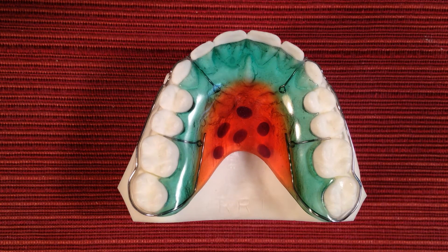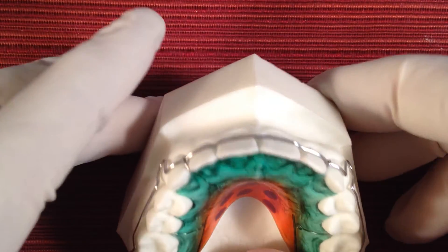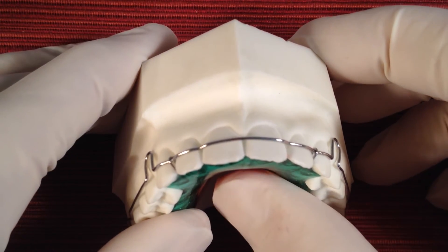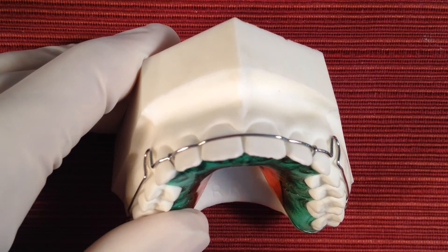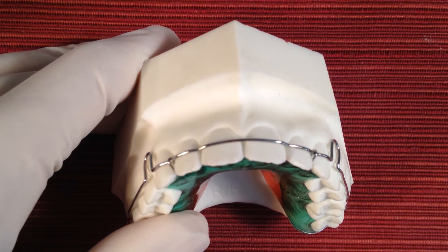The cons or disadvantages for the wrap around is that there are no clasps to hold this retainer in, so sometimes it doesn't stay seated in well and it can be flipped up and down by your tongue. And still you have that labial arch wire across the front of your teeth for everyone to see. There are some wrap around retainers that have a clear strap that goes across the front of the teeth; however, you can see both edges of this strap across the front of your teeth versus Hybritain which covers all of your teeth with clear plastic.